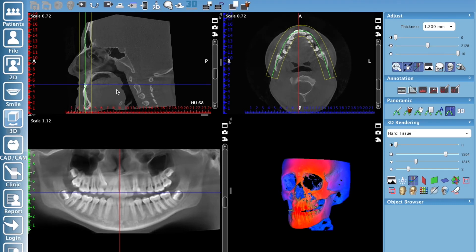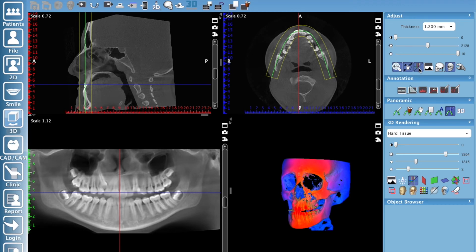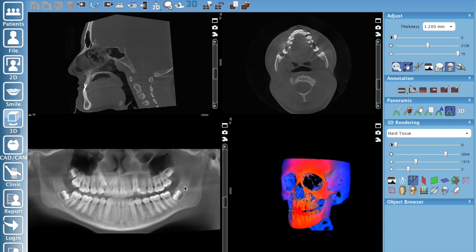Now we want to create our pan and take a 2D image of this. If you've got crosshairs in the way, hit your 'show height annotation overlays' button to turn that off — now they're gone. Now we can take a nice quick shot of that pseudo pan for a 2D image.